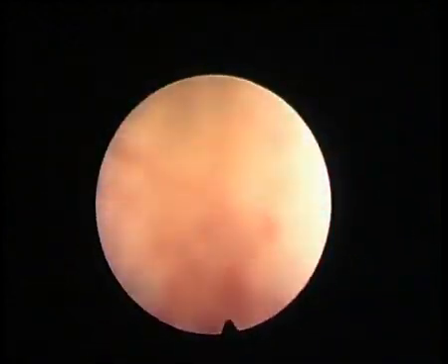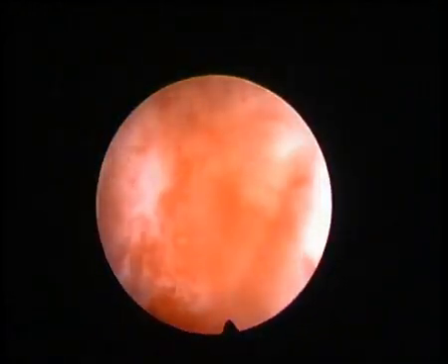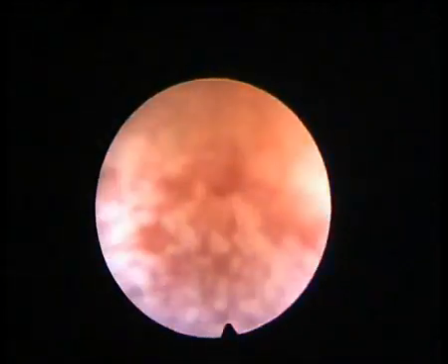Instead, vaginoscopy is performed, where the hysteroscope is introduced directly into the vagina, and hand pumping of the distension medium separates the vaginal wall sufficiently to allow localization of the cervix and passage of the scope into the external os. Prior to vaginoscopy, the tip of the scope can be encircled with a gloved hand, which acts as a model uterine cavity to allow initial focusing of the instrument.